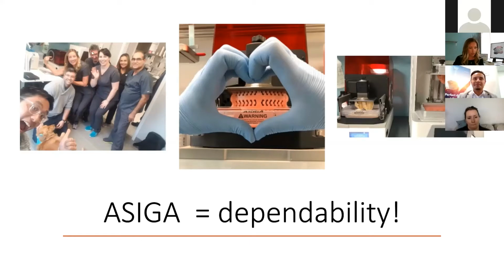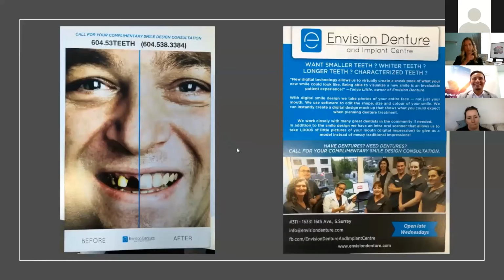So obviously we've got Mark and Chris here and the team, and we've been working with printing immediates and some ear protectors through the COVID. So just a few fun pictures. This was just a quick sample.